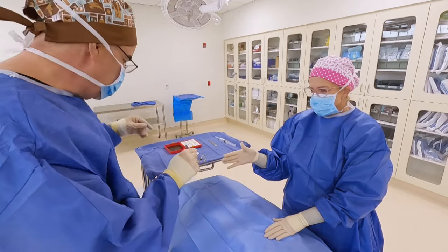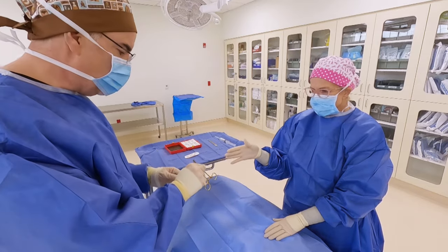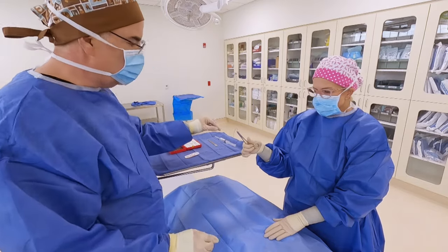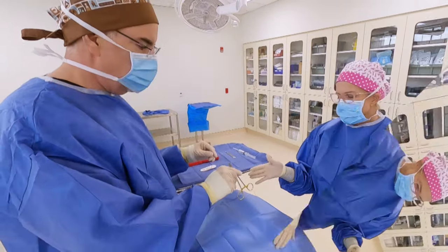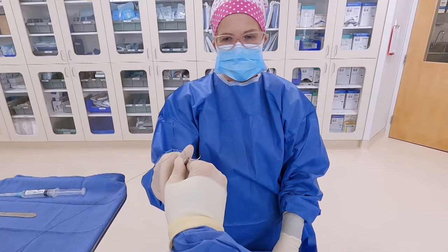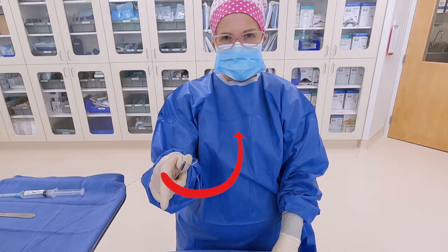Controlling the suture is very important because it's easy for it to fall over the edge of the table and become contaminated, so make sure you're controlling it as you pass it over the back of her hand. To confirm the needle is oriented properly when placed in her hand, the needle should be pointed at her heart — notice how it's pointed inward and upward towards her heart, not away towards her shoulder. That's how you know the needle is oriented correctly.